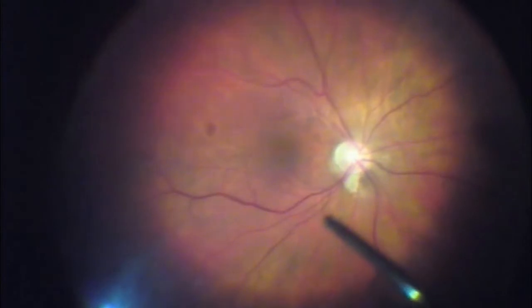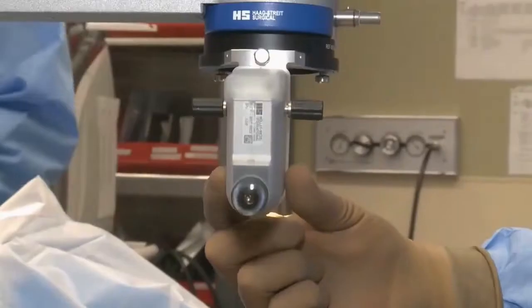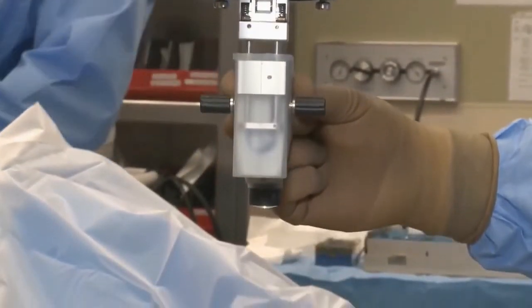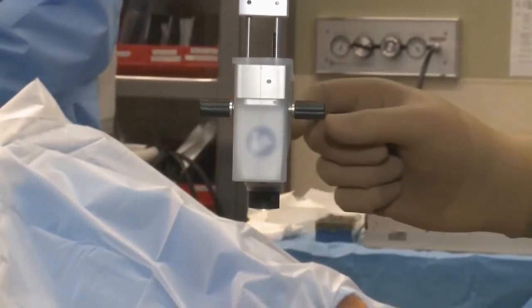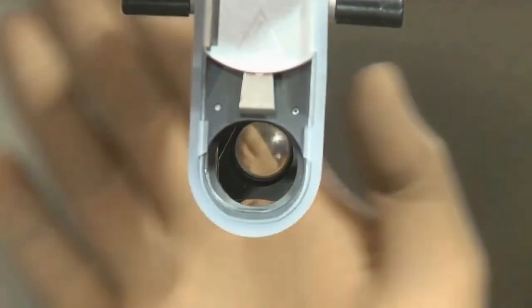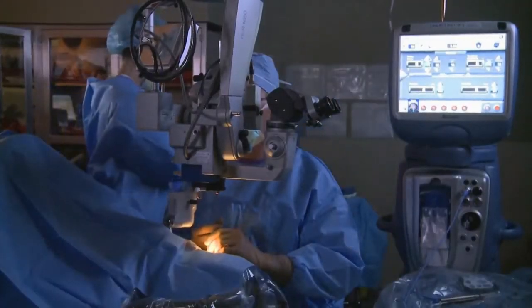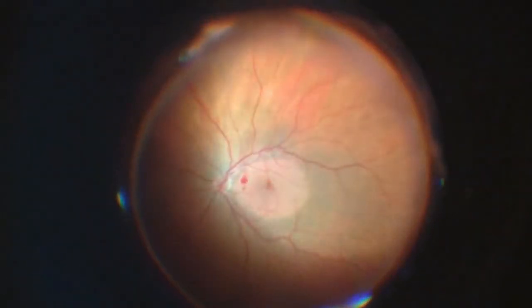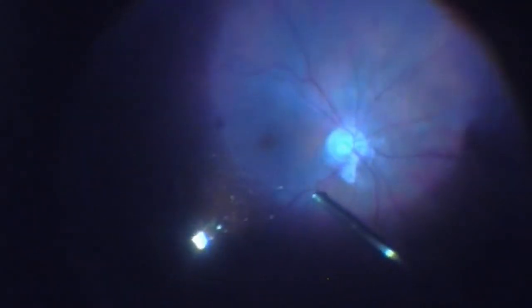Its unique features include robust precision mechanics that maintain stable centration at all times, and an integrated inverter that eliminates the need for an external inverter in the microscope stack. This is particularly useful where the scope is shared by both anterior and posterior segment surgeons.